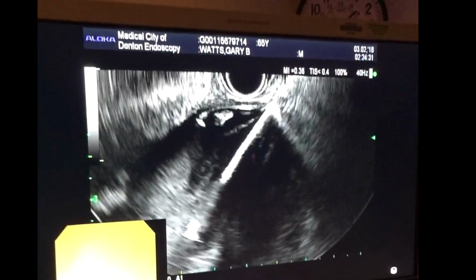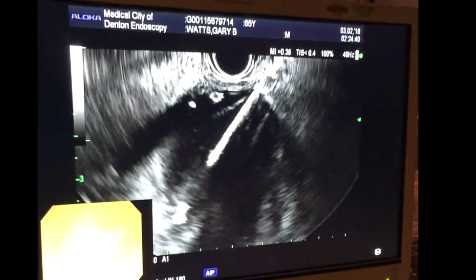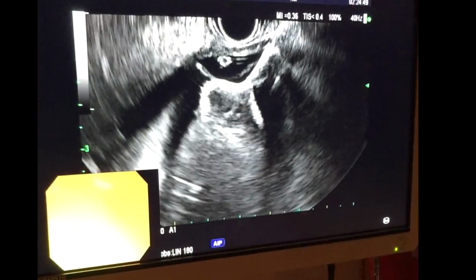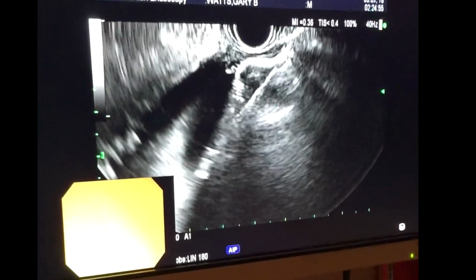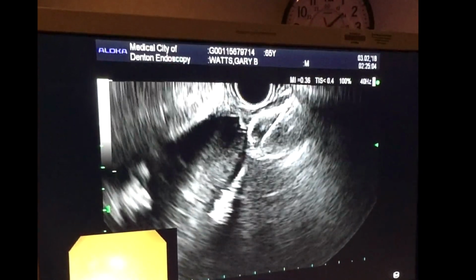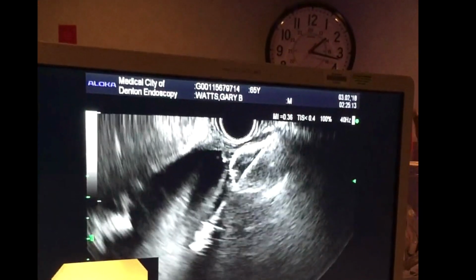At this point, I locked the catheter in position and prepared for the deployment of the outer part of the stent, which has been deployed, as you can see, and I'm pulling it back so that the cup-shaped Axios stent part has changed its shape, and it is very close to the gastric wall.